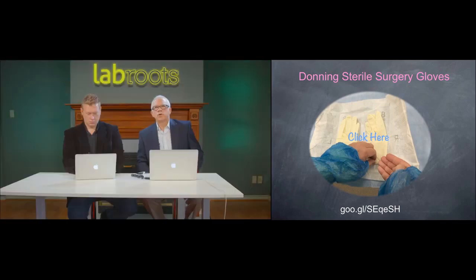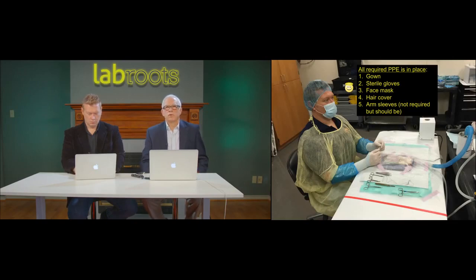So what is the required personal protective equipment for an individual who's doing rodent survival surgery? One, he should be wearing a gown, a lab coat, sterile gloves, a face mask, a hair cover. And even though, again, the arm sleeves are not mentioned in the guide, we believe they should be required and they should be disinfected. Why do I say that? Look at this right here. Mitch, and you see that in another picture, is not just working here, but he's moving his arms back and forth. He'll be moving his arms to pick up materials here, back and forth all over the place. And in the process of doing that, the sleeves of his lab coat could contaminate the field, so by using these very inexpensive plastic sleeves sprayed with disinfectant or sterilant, he's less likely to contaminate the field.